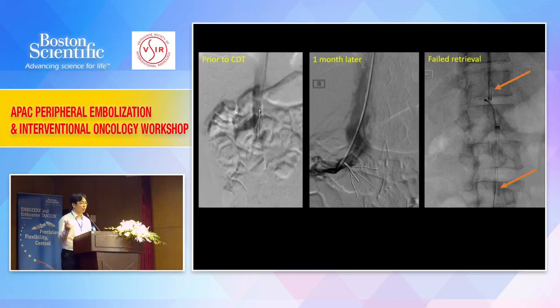How about this patient? Okay, this patient has a GTX filter. Prior to starting the catheter-directed thrombolysis, it was placed pretty centrally. This is a young man who goes to Bali. He's Japanese, in fact, but he windsurfs in Bali, which I'm sure is what Dr. Anore wants to do. But okay, so he windsurfed.